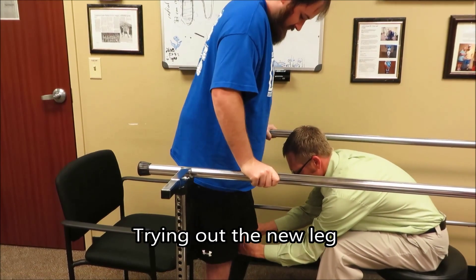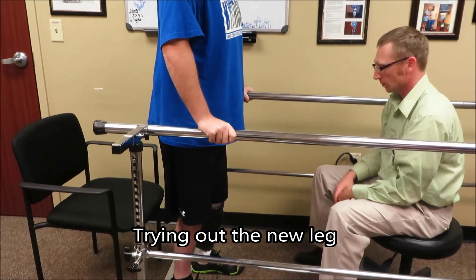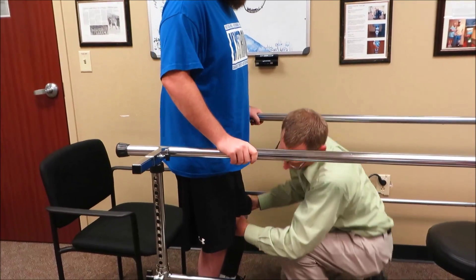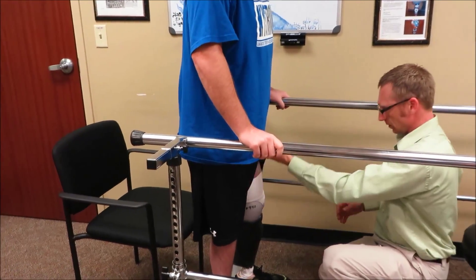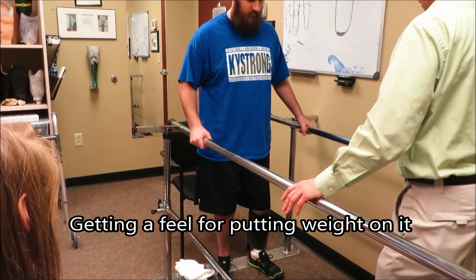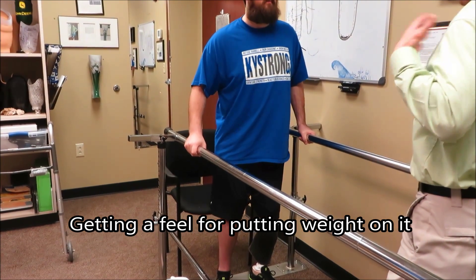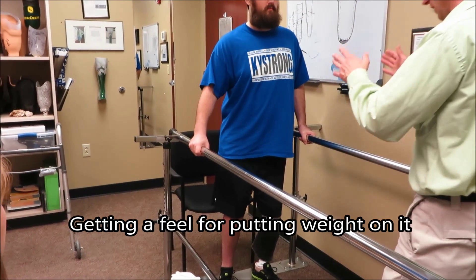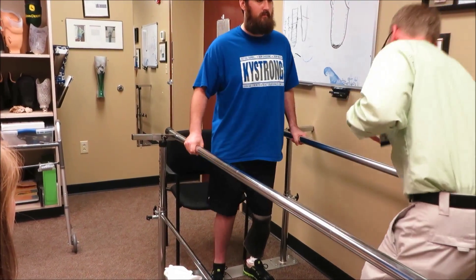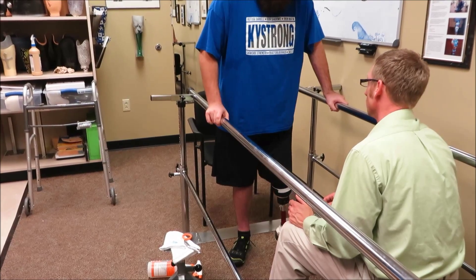We'll go ahead and bring your foot back under you. All we're looking to do right now is just kind of stand. I'm going to leave this a little low for right now. Go ahead and keep your hands there, just shift over and hold it — over your prosthesis. See how I got my chest up and over? Right like that. Exactly. And shift some weight back over to your good side. Are you getting any discomfort right now, just standing and moving your leg around?